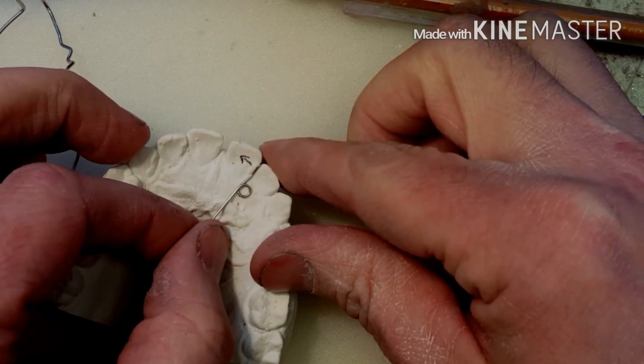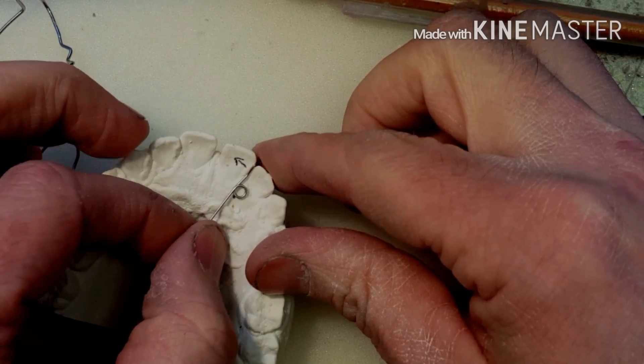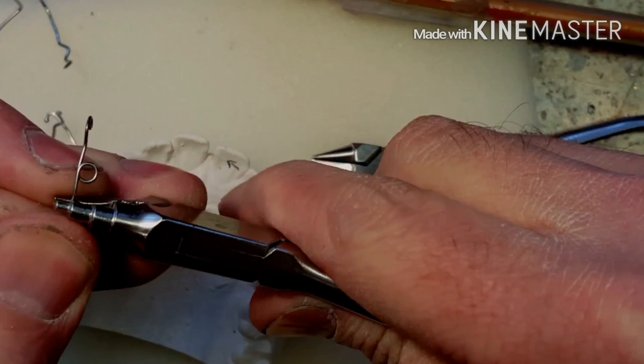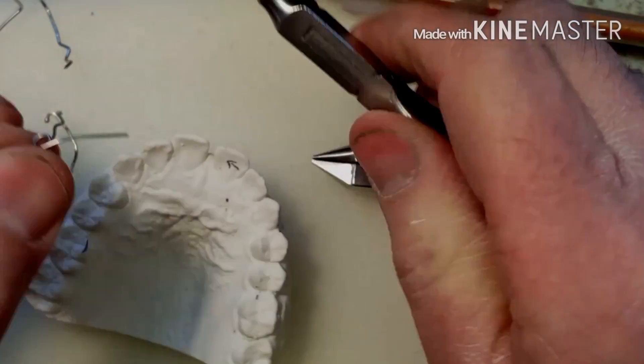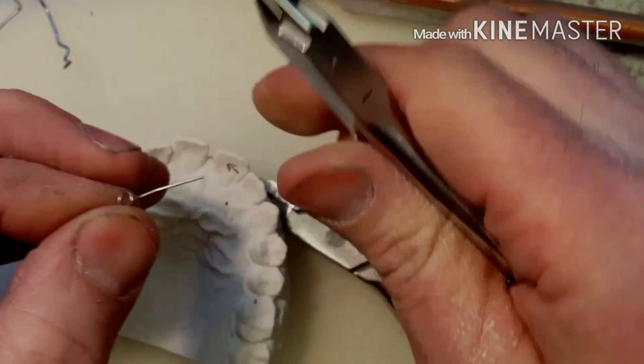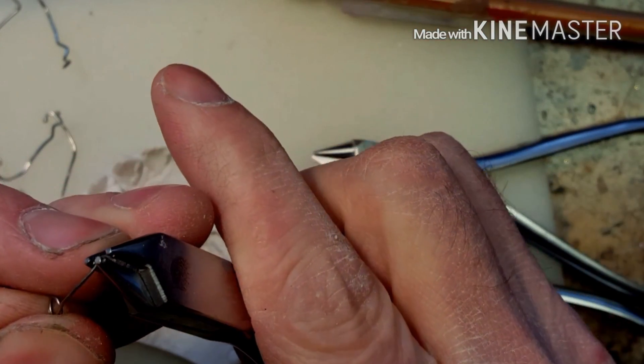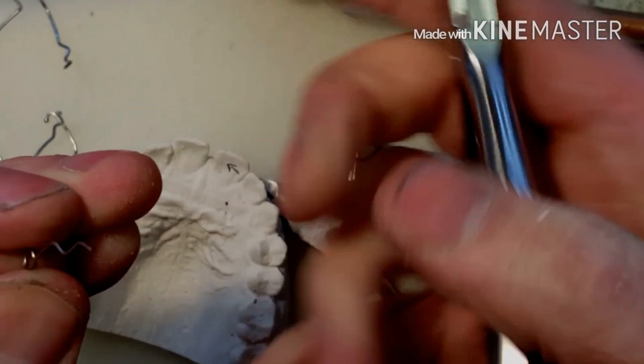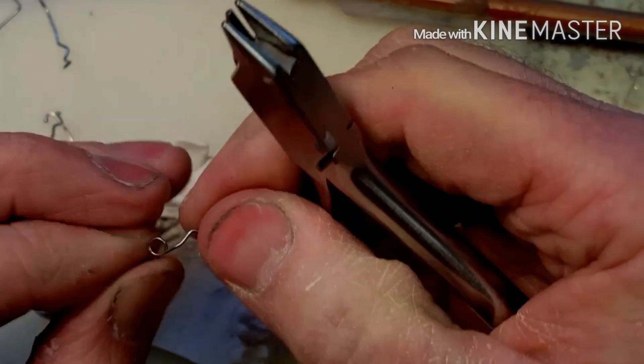I drew a little line on the model to show you which way I want the forces to be pushed. By twisting the spring to the right side, you can adjust the spring and twist it left. I'm going to put a couple of zigzags in there just to get some retention in the acrylic.